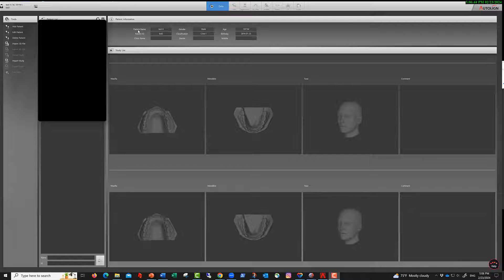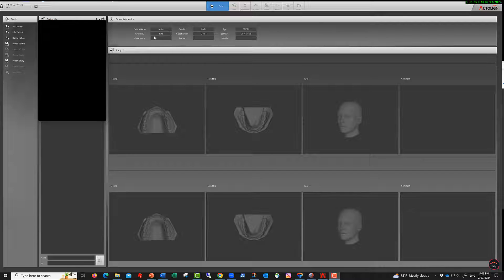The first step is to create a patient. I'll add a patient — this one is called 'Test 4 Patient,' is male, and has a Class 1 malocclusion. I won't walk through the full creation process but it's straightforward.